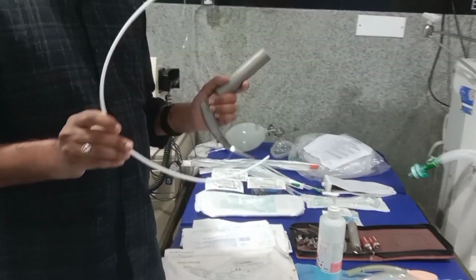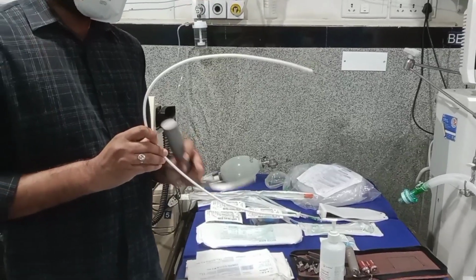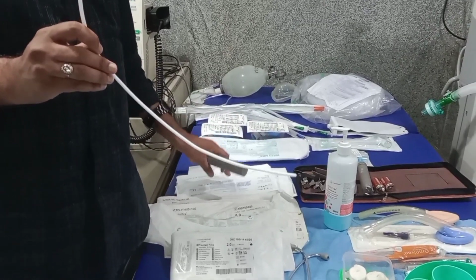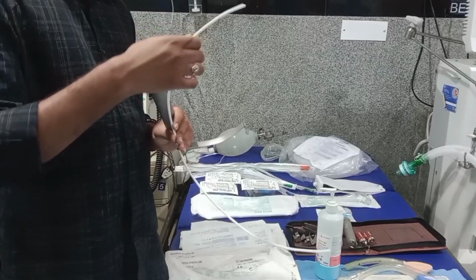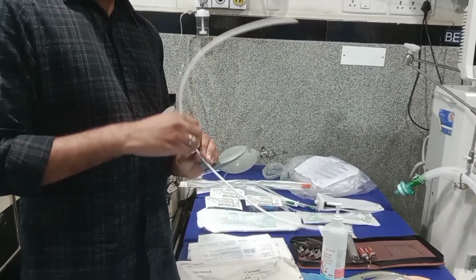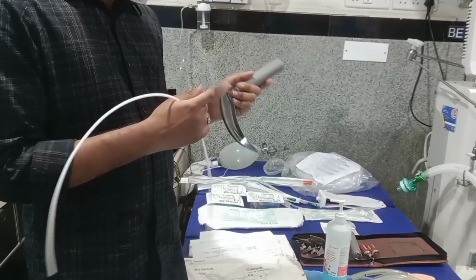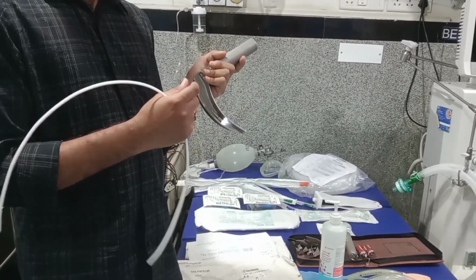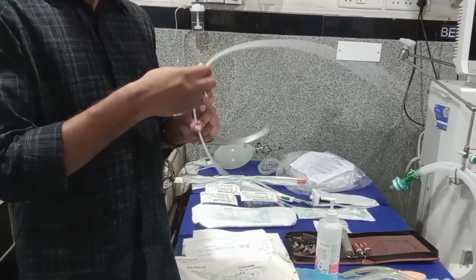The scope should be in hand, and the bougie into the trachea. Then we will take the tube with the nursing assistance. We take the tube and put it over the bougie. Once the tube is completely pushed down, we should hold the bougie. Then we should make sure that the tube passes through this line of the blade. We can slowly push with the blade inside, so that we can push the tube.